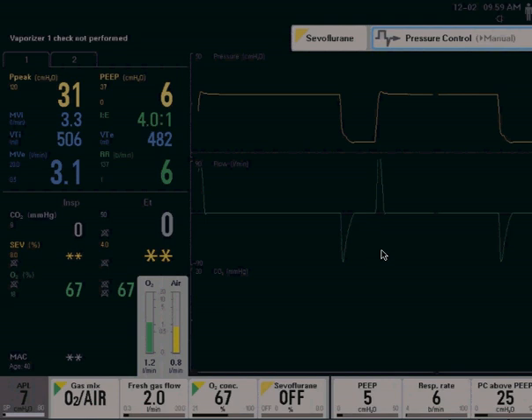So this is a consideration for practitioners who like to set a T low. I do not have a T low setting, but to set a release phase to target a measured peak expiratory flow rate between 50 to 75%, that I cannot do with this machine. However, there are 2 other ways to set your T low.